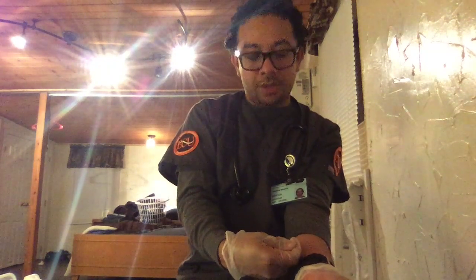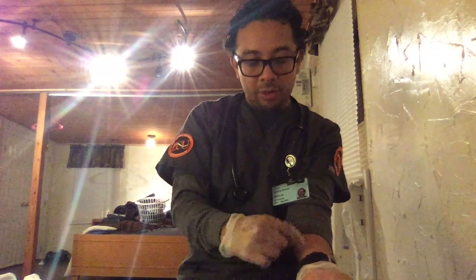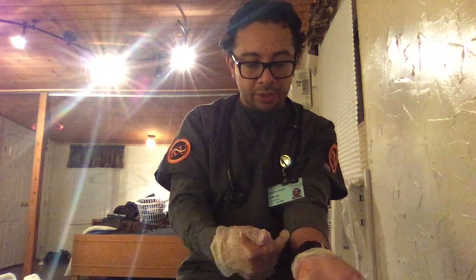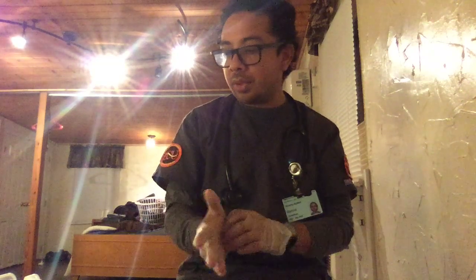I will inject everything, and a little wheal will appear on the skin, which is like a little raised bump. You inject all the medication at a 10-degree angle, and then you pull it out at the same angle. Again, you get rid of your needles in a safe place.